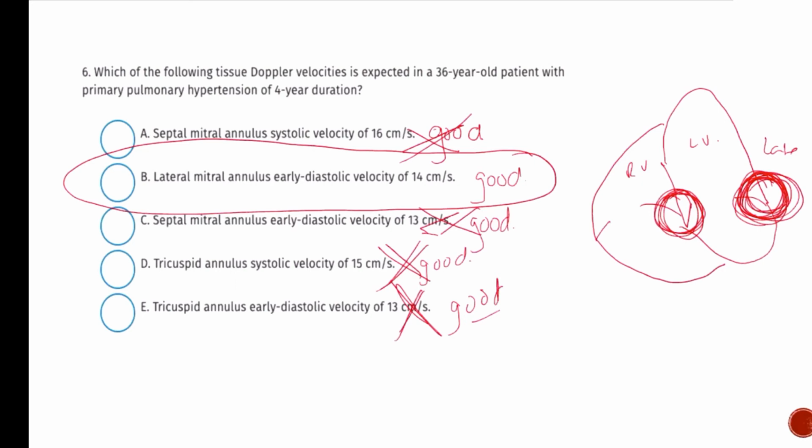Dr. Bartok asked a question. Any mention of hepatic venous systolic filling fraction for right atrial pressure assessment? Is that not widely accepted? So it actually is. We're going to go over it. I think there's a question on it later, so I'll go over it in a little bit.